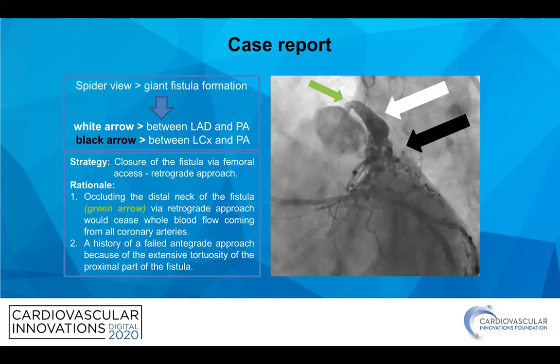Our strategy was to close the fistula formation via femoral access and the retrograde approach. Our rationale behind this decision was that occluding the distal neck of the fistula via retrograde approach would cease the whole blood flow coming from all coronary arteries at once. Additionally, the history of a failed antegrade approach due to extensive tortuosity of the proximal part of the fistula guided us toward this decision.